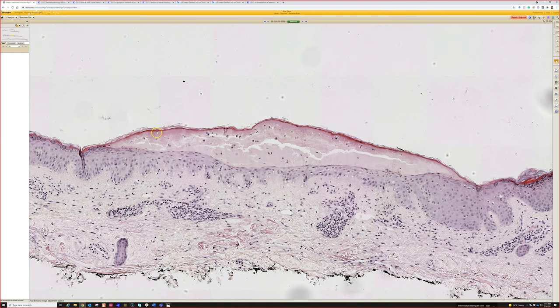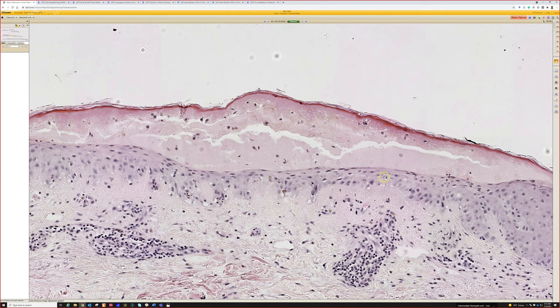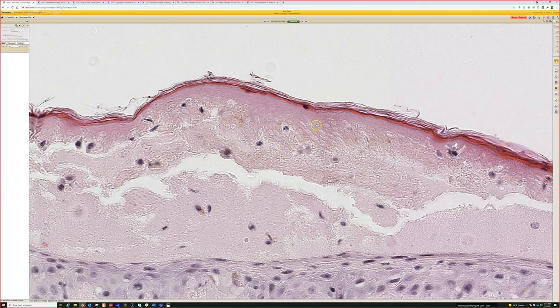Something killed the epidermis here and it lifted off. Actually this epidermis is new — it's regrown. The keratinocytes get a little bit big and glassy and almost atypical because they're regenerating and reactive, streaming and stretching across. This is either a blister that has lifted off and the roof died and then re-epithelialized, or sudden death of the epidermis that detached and then the epidermis re-grew underneath. You can see the ghost outline of keratinocytes — the whole epidermis died. You can see the little ghost outline of dead keratinocytes, totally pink, nuclei gone. Even the keratin layer is nice normal basket-weave orthokeratosis, which tells you this happened like instantly or overnight — the epidermis didn't have any time to respond. It just died right away.